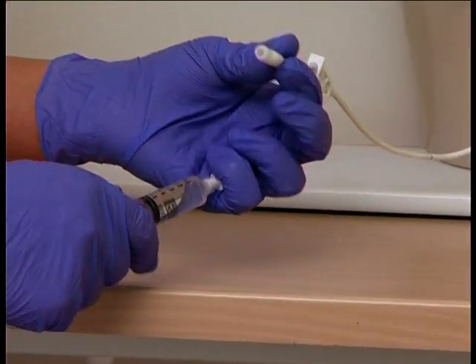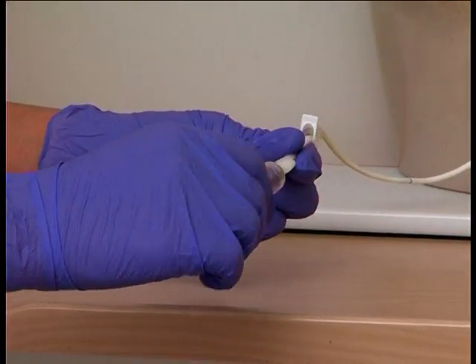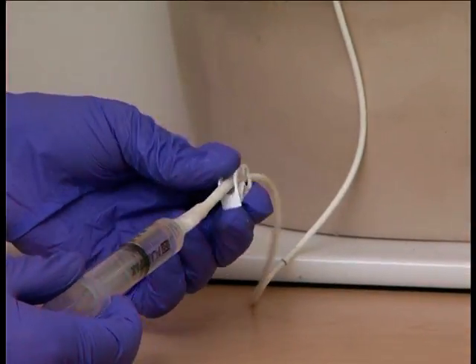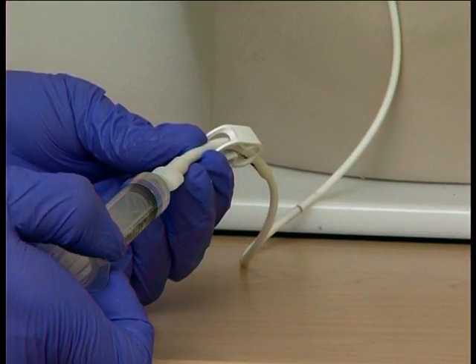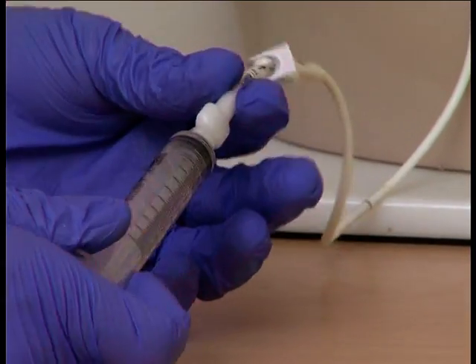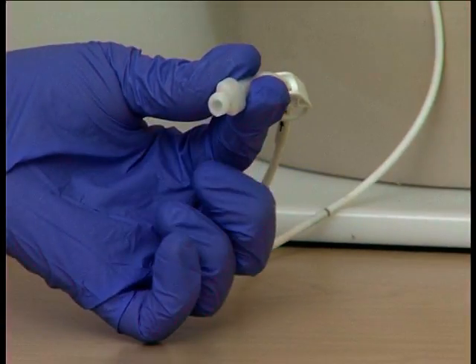Using a two-hand technique, remove the end cap from the 0.9% sodium chloride syringe, taking care not to touch the key parts. Connect the syringe onto the CVC. Throw the end cap into the rubbish bag. Unclamp the CVC. Using a push-pause technique, inject the 0.9% sodium chloride into the CVC. Apply the clamp as the last half ml is being injected to create a positive pressure. Remove the sodium chloride syringe and throw it into the rubbish bag or onto the bottom of the trolley.